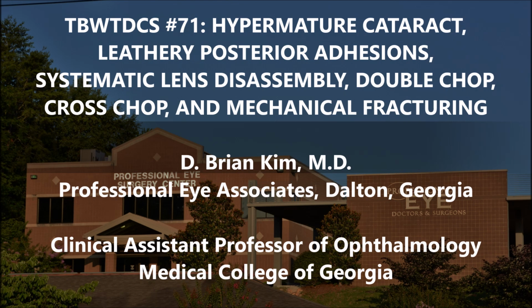And you'll see there are very stubborn, leathery posterior adhesions and how I use a scissoring technique, amputating those posterior adhesions between the chopper and the phaco tip. I'm going to very carefully and patiently break this lens down, and you'll just see that it's not that easy to break down a big lens like this.